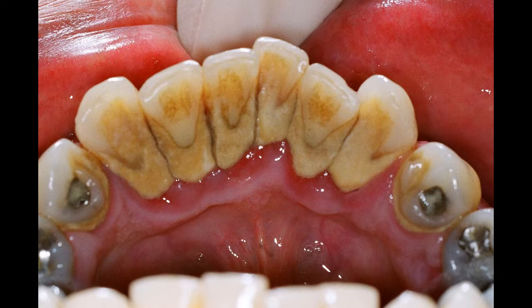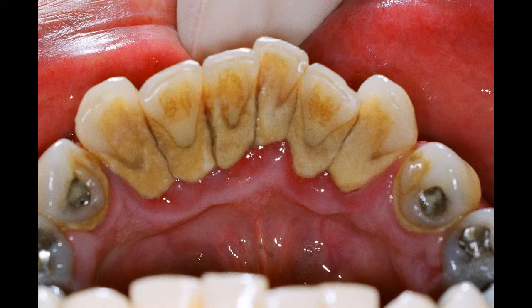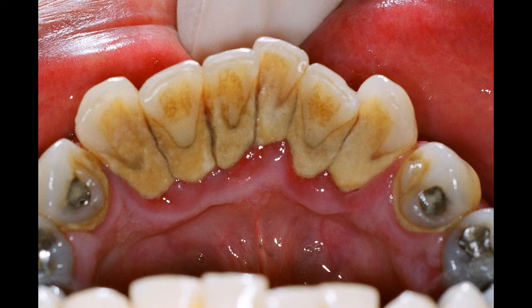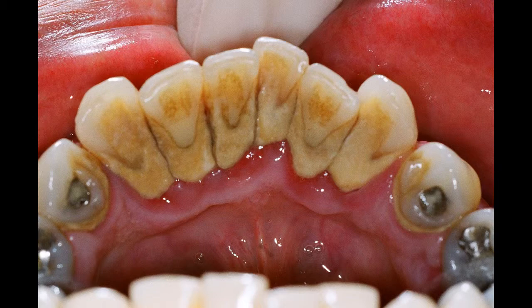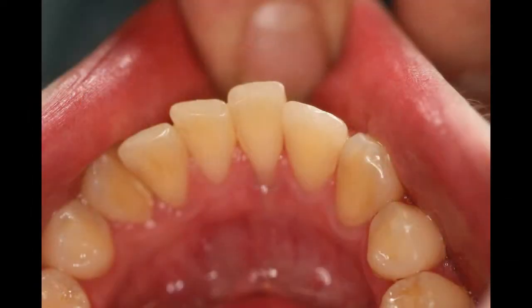The first picture that we take is a pre-op picture of the lingual of the lower anterior. This goes to value. Your patients — our patients — can't see that surface, but on 99% of them there is hardened plaque and calculus there all day long. Maybe even some bleeding if we touch it just a little bit before we take that picture.